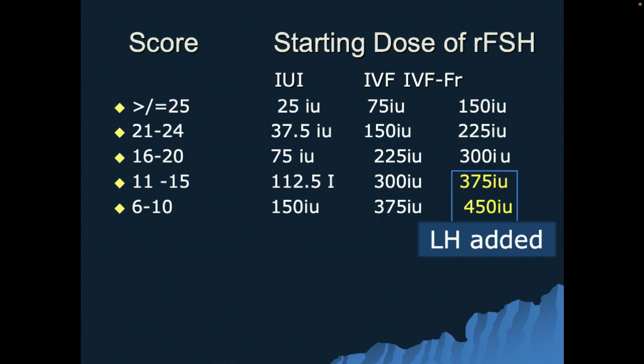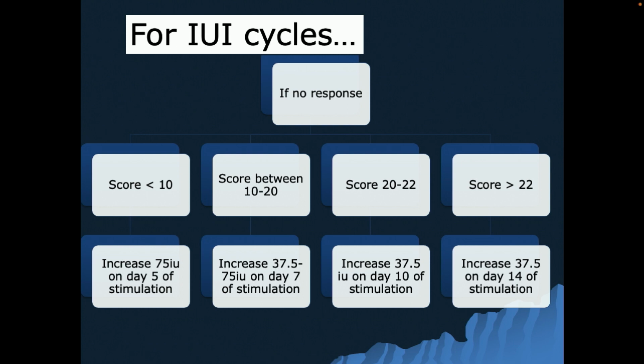So that is important. Now, if you are doing a gonadotrophin cycle, whether it is a letrozole plus gonadotrophin or only gonadotrophin cycle, the daily dose remains the same. Only the number of days of stimulation decreases, right? So what you do is, you are going to do a first scan on the day you are going to start gonadotrophin. And on that day, as we have discussed earlier also, if all the follicles are smaller than 10 millimeter, you directly call them after 5 days. When I say less than 10 millimeters, we put a flow and we confirm that they are not dominant. Right? That means no dominant follicle, directly after 5 days.